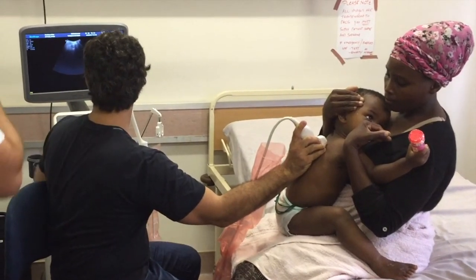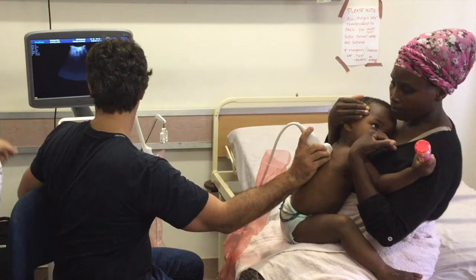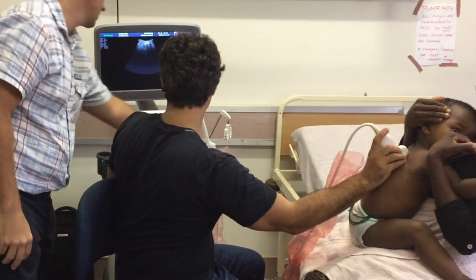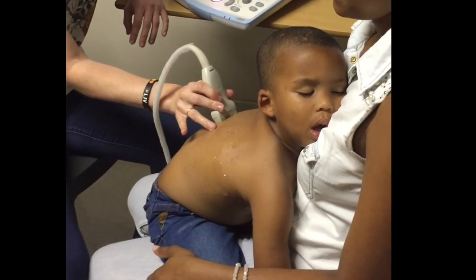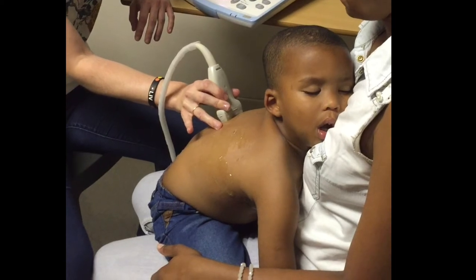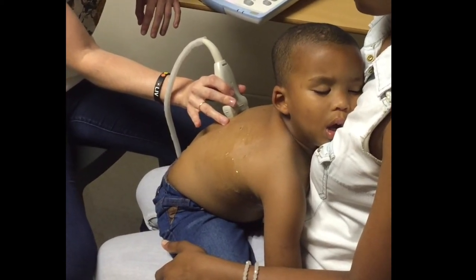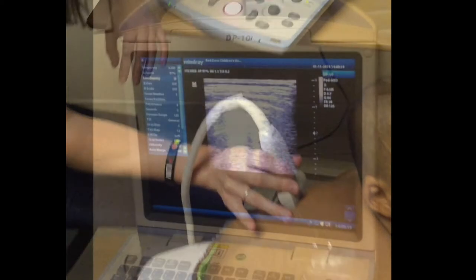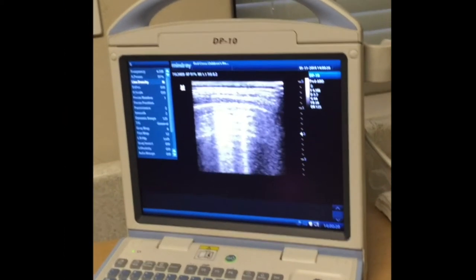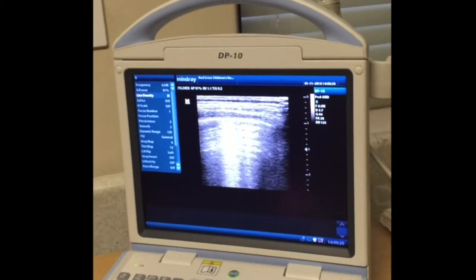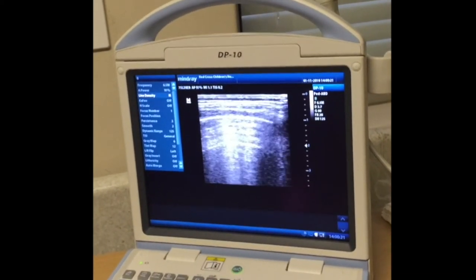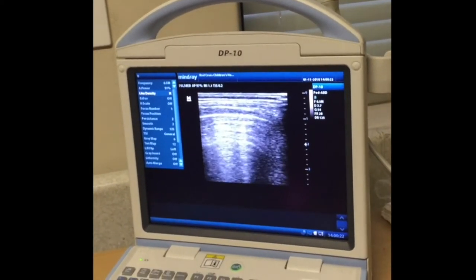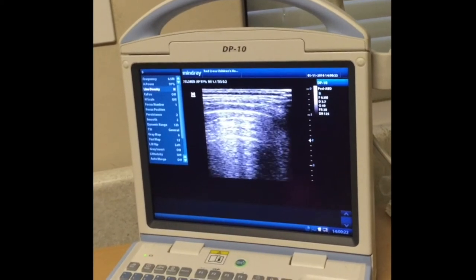This is me doing an ultrasound on a child in a small rural hospital. The child is most comfortable in the mother's arms and of course I'm getting some help with the buttons because I'm not familiar with the equipment. This is a transverse orientation of the probe and it's not important which is right and left in lung ultrasound because there's no anatomy other than the lung itself. You can see that there are no ribs in the imaging view because we are imaging between ribs in a transverse orientation.